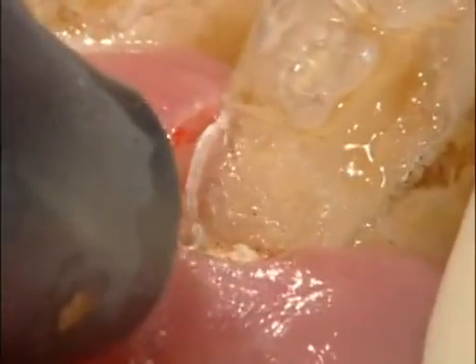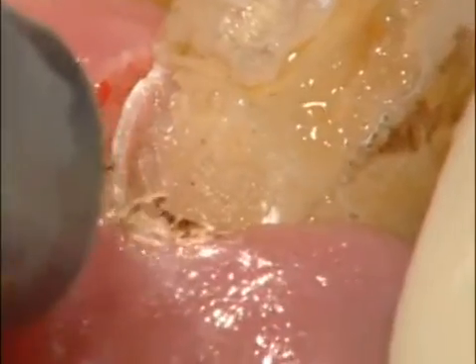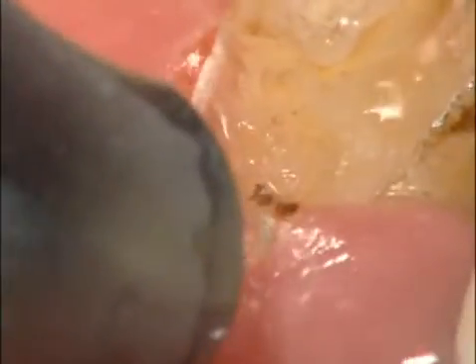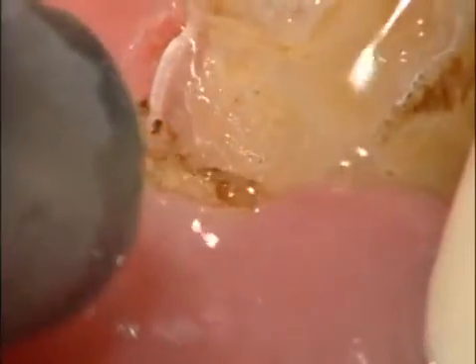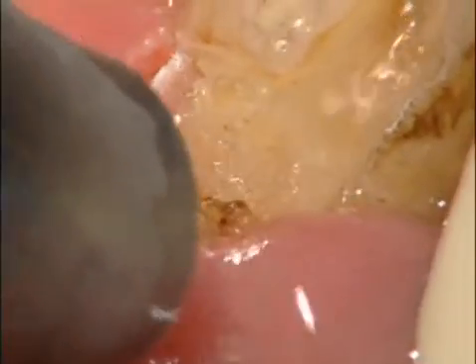So now I'm cleaning up the tissue again a little bit more at that 1 watt setting that I mentioned before. This laser in the soft mode allows me to have a nice smooth cut and contour the tissue right where I want it to be.